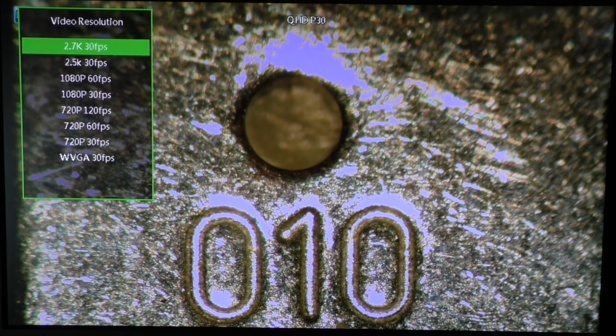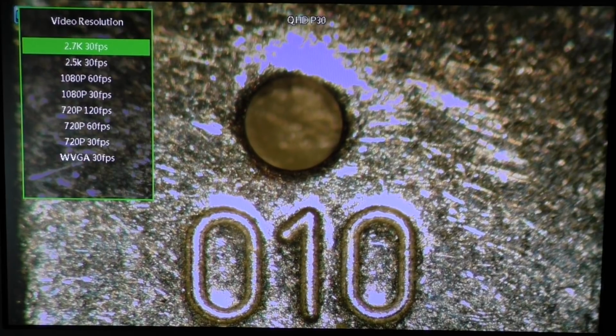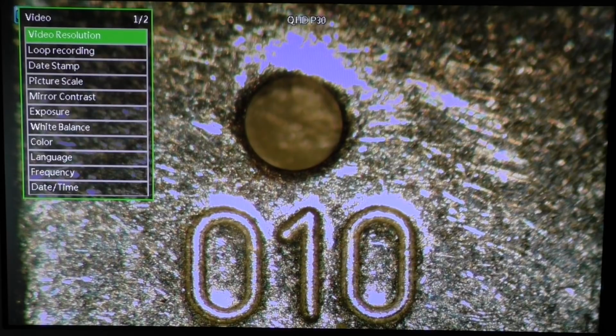Video resolution, you can go up to 2.7K at 50 frames or 1080 at 60 frames, 720 at 120 frames. So I think I'll leave it on the highest possible resolution. I don't need so many frames, that's not the problem, and if I don't like it, I can still change it.